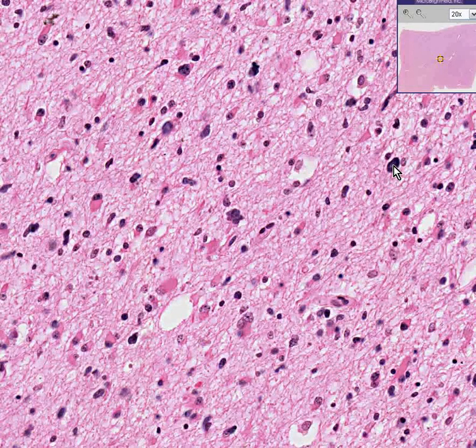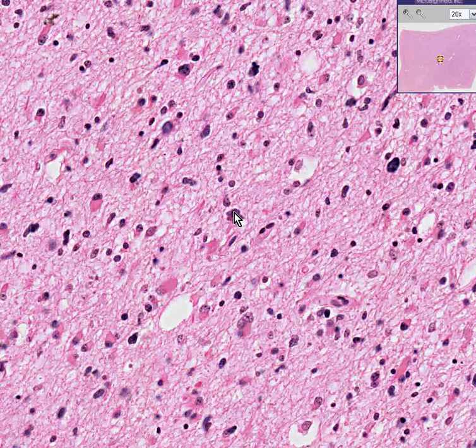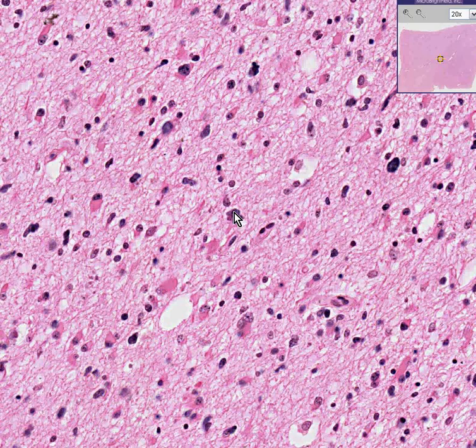Here's one that makes you a little bit worried. And at this point, you no longer have to worry or wonder whether this is reactive glial cells or glioma. This is a glioma.